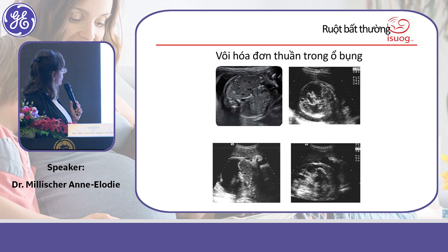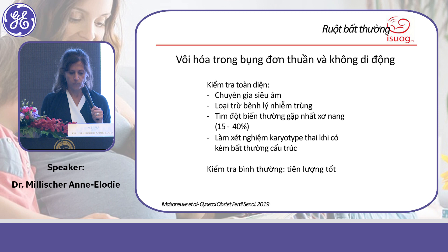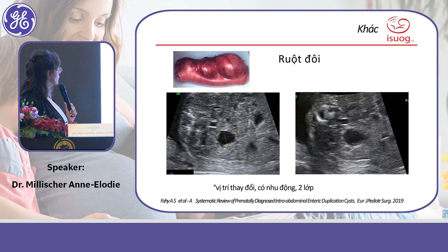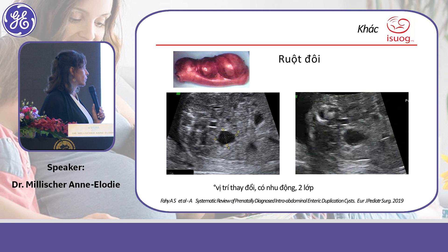Here is an example of hyperechoic bowel in severe IUGR. If you see calcified components within the bowel contents, suspect an association with intrauterine growth restriction. Regarding bowel duplication — when you encounter a duplication cyst, know that it is more frequent in the small bowel than the large bowel.